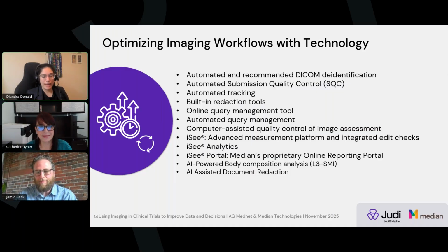Yes, so with that test validation process, we recommend this option for sites, especially when it comes to a complex study or a complex criteria such as Lugano or RECIL. So having that test validation process in place allows us to ensure that images being collected are meeting the parameters based off of the image acquisition guidelines. Now, if they submit to us and the test validation fails, we do reach out to the sites explaining why they failed, walking them through the process again and asking them to resubmit the images for that test.